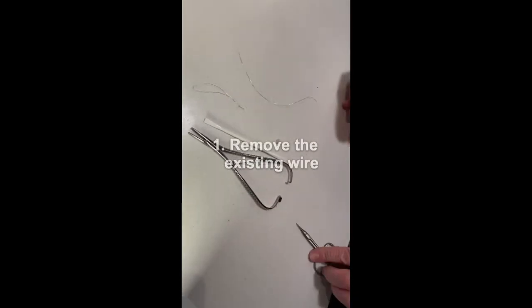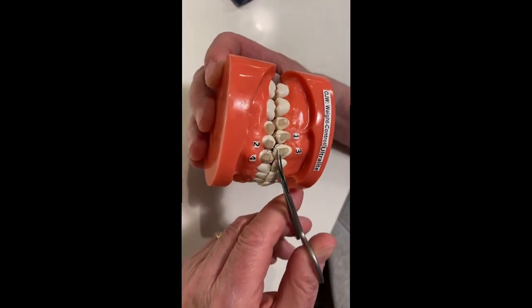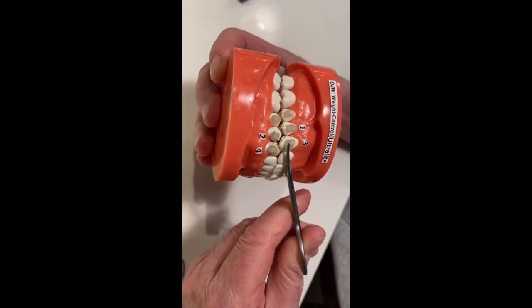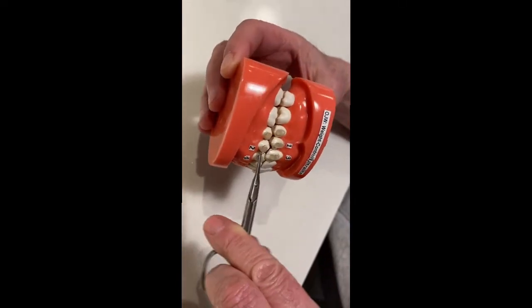First, we're going to remove the wire. It's so simple — it's beyond simple. You just simply cut the wire, and then lift it back on and off.